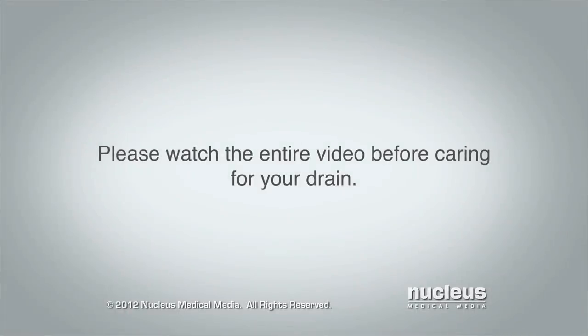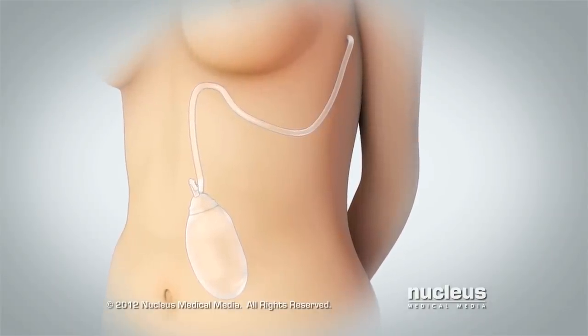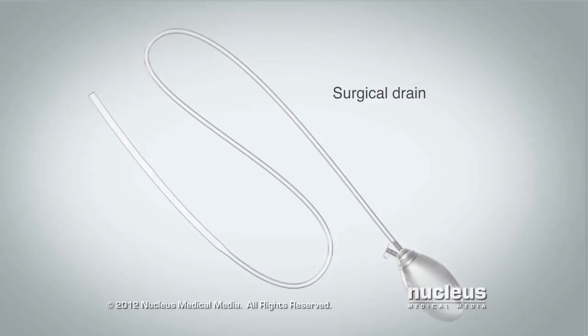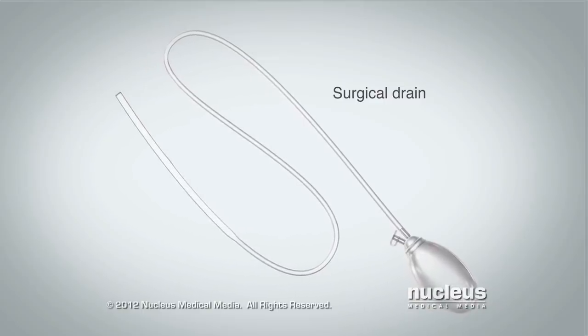Please watch this entire video before caring for your drain. This video will teach you how to take care of your surgical drain. Surgical drains remove fluid from under your skin near your surgical site. This helps prevent infection and encourages healing.